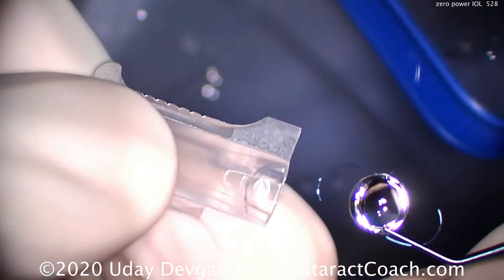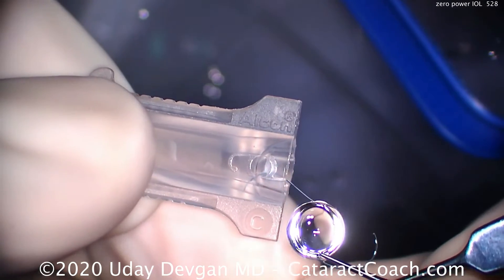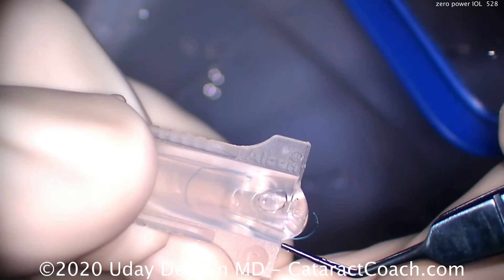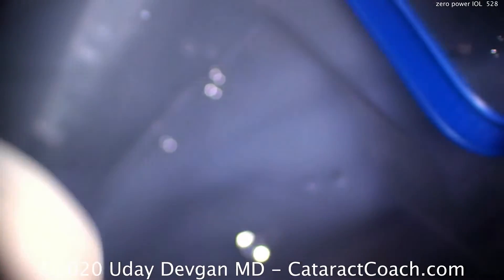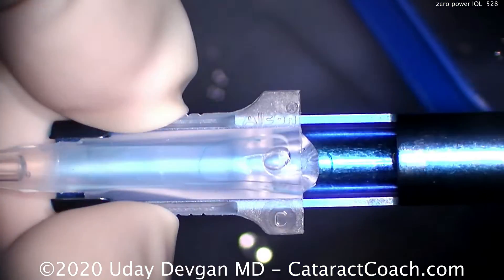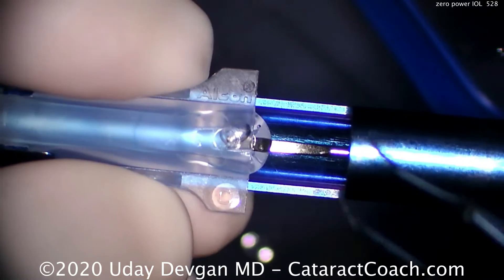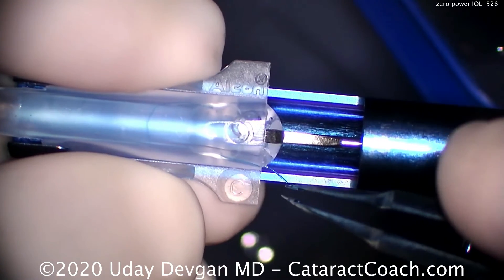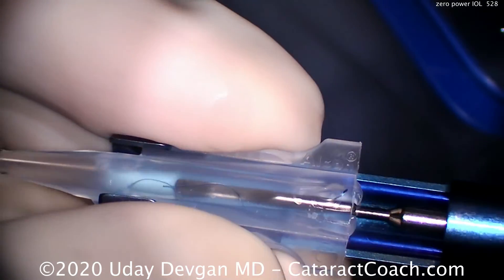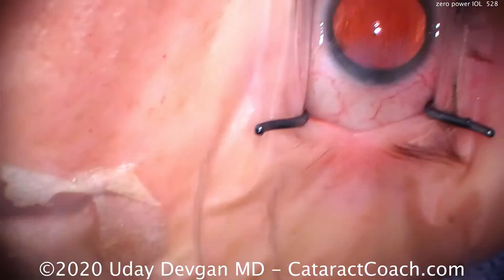Now to put it in the cartridge — traditionally we use a B cartridge, but here we're going to use a C cartridge. The C cartridge is slightly smaller, and it's also missing that peg. Normally in a B cartridge there's a peg right about there. So since we can't put the haptic on the other side of the peg, we'll place the cartridge here and advance just a tiny bit. What we want to do is grab that trailing haptic and put it over the edge of the injector. Now as I advance the plunger, the haptic is in good position and does not get kinked or damaged. That's the trick in doing it.